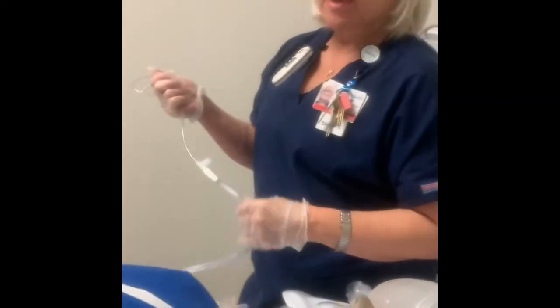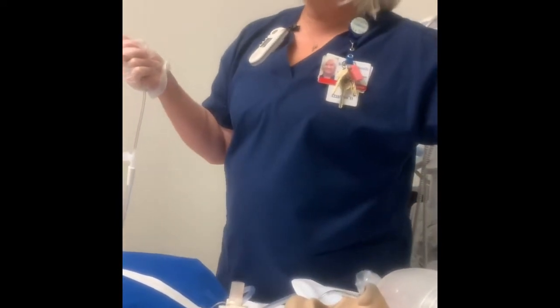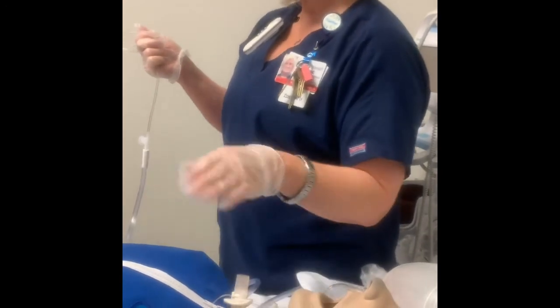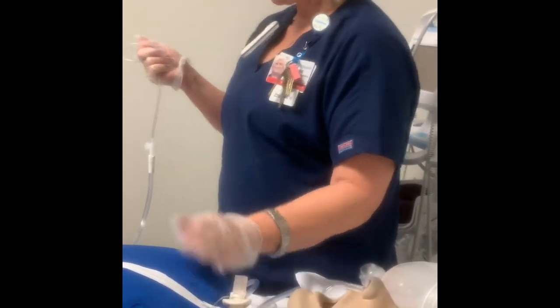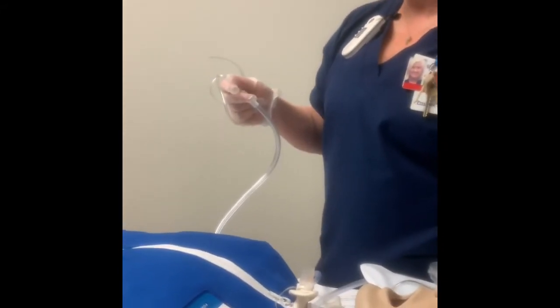So anyway, any questions on the suctioning? What's the max I can put this at? 150. Okay, and how long do I stay in? 15 seconds. And do I apply suction as I'm entering the trach? No. Okay, very good. Who's going to be our brave soul to pop up here and do this?